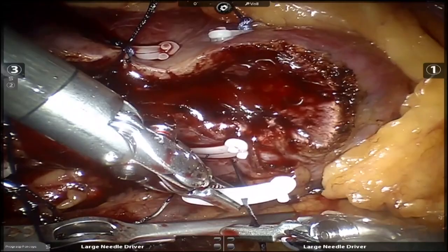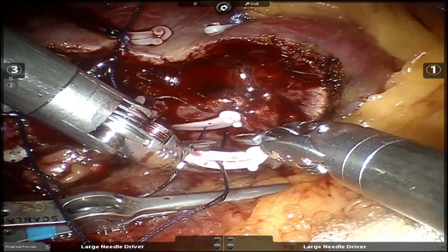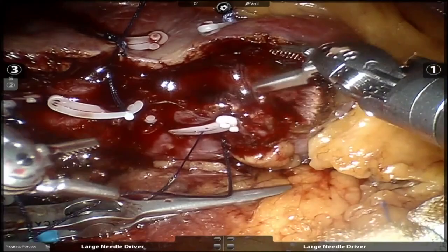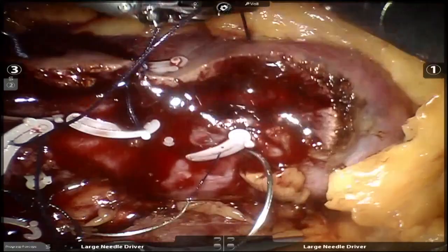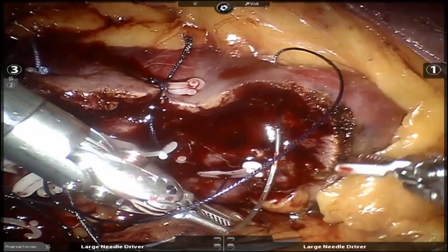Hem-o-lok. Actually, you know what? I don't like that stitch. Give me another stitch, Brando. Because you don't need a clip remover. No, this is wherever you need to do. You need to do what you need to do, right? Right, right. But I wouldn't be able to do this with a V-Loc, reverse the stitch. Yeah. Just drop it, Brando. You're fine. You're awesome. Give me a sucker.